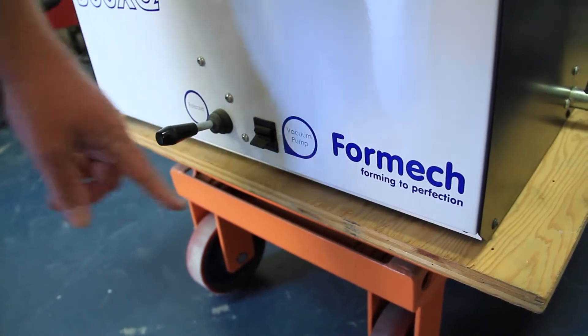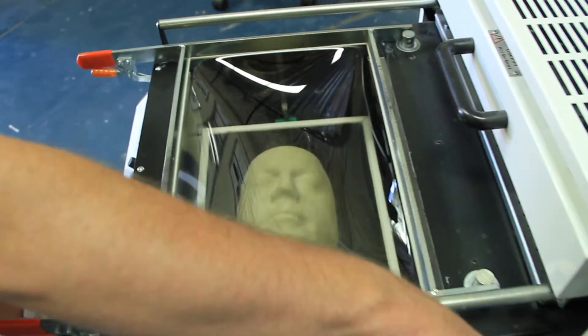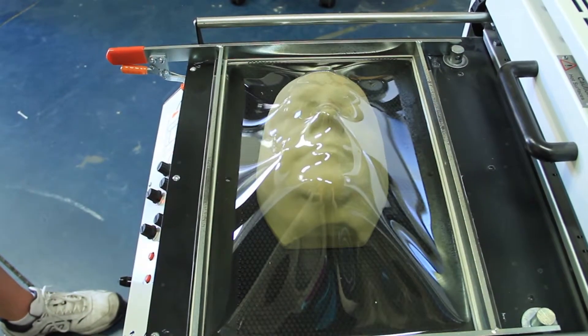Next, the pump switch must be flipped on and the lever must then be pulled down towards the floor. This will then bring the platen with the mold up to the heated plastic and create an impression.